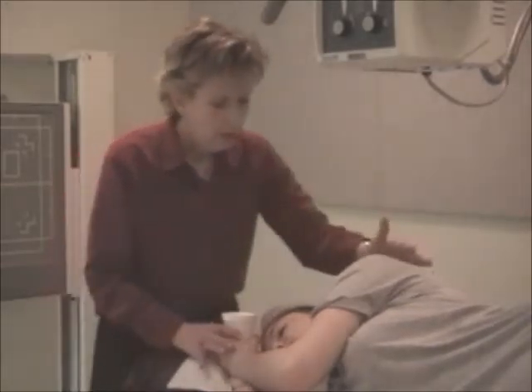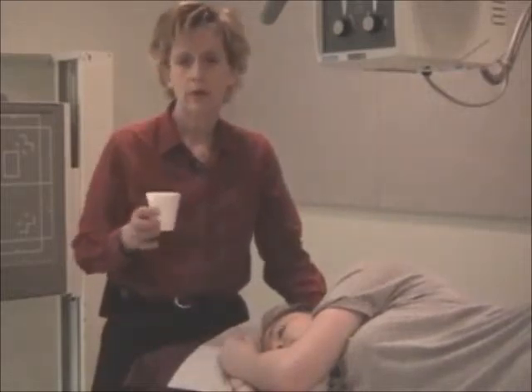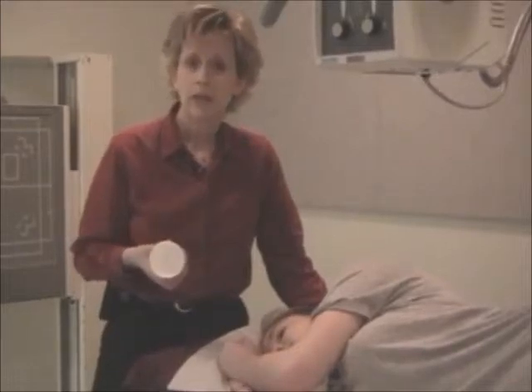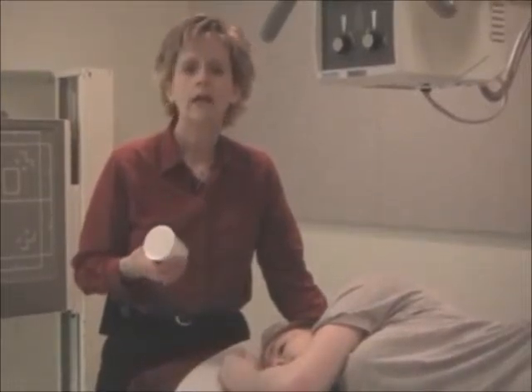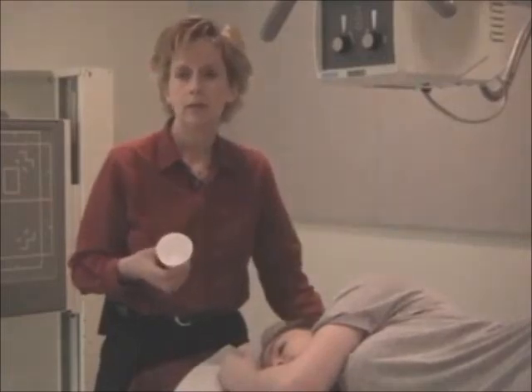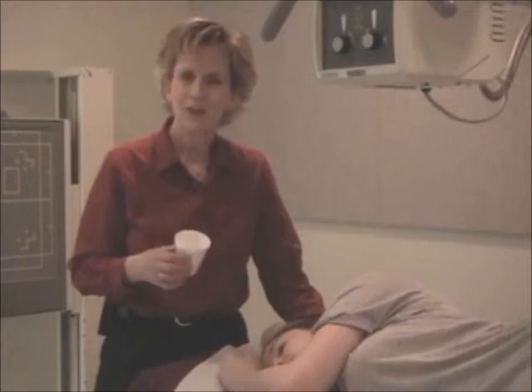Okay. Some techs like to take the barium and make it thicker, or there's Gastrografin. Sometimes there's barium tablets that patients take. Sometimes it's a little cotton ball dipped in some barium if they're trying to detect a foreign object. So you're going to run into all kinds of scenarios out there doing your GI work.